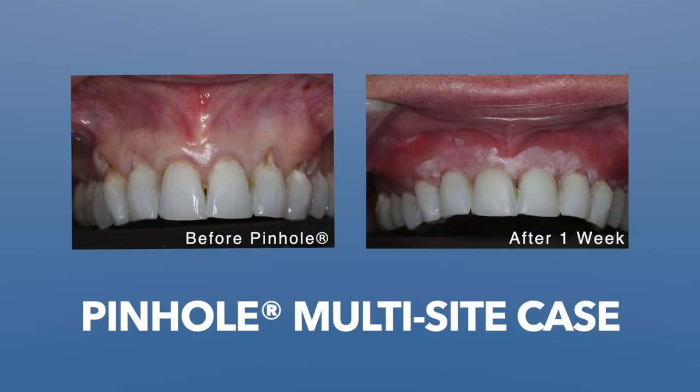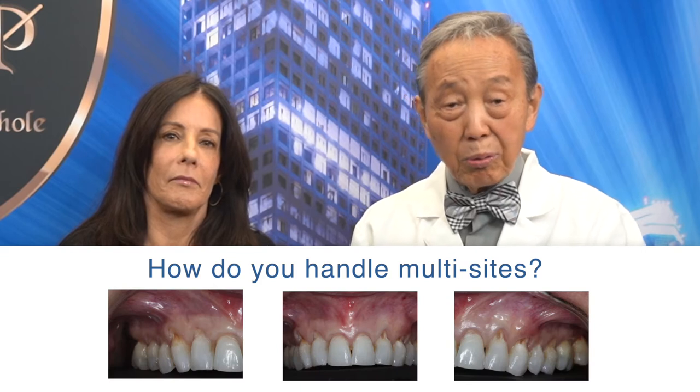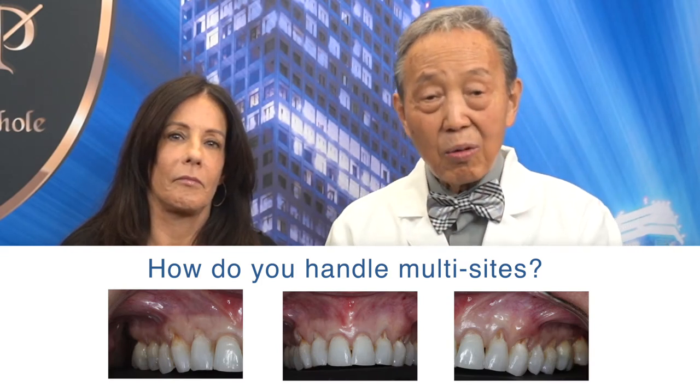I'm sure this is not a rare event when you see people with multiple sites of recessions — 2, 3, 4, 5, 6, 7, 8, 9, 10 — like this case. What would you do? This is actually 12 teeth.